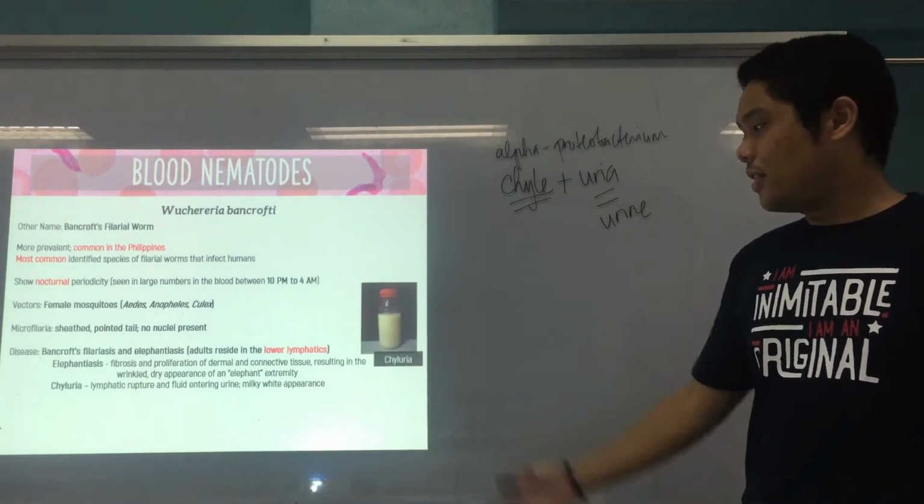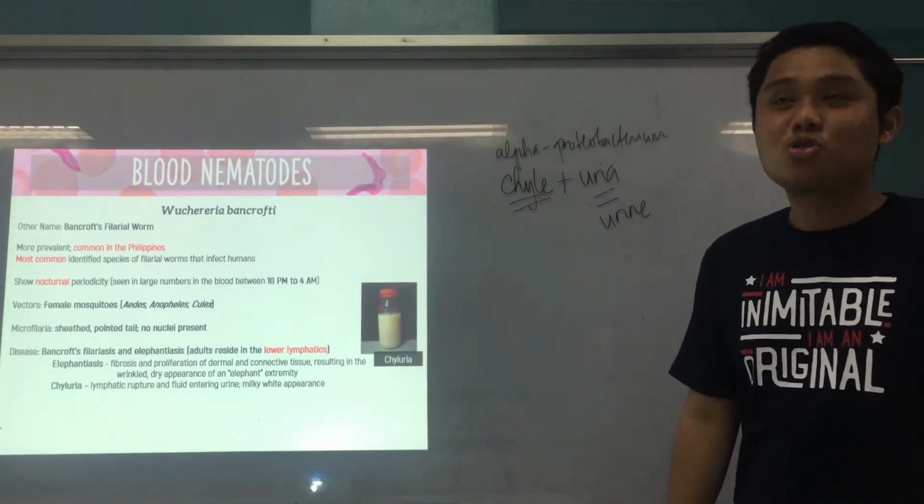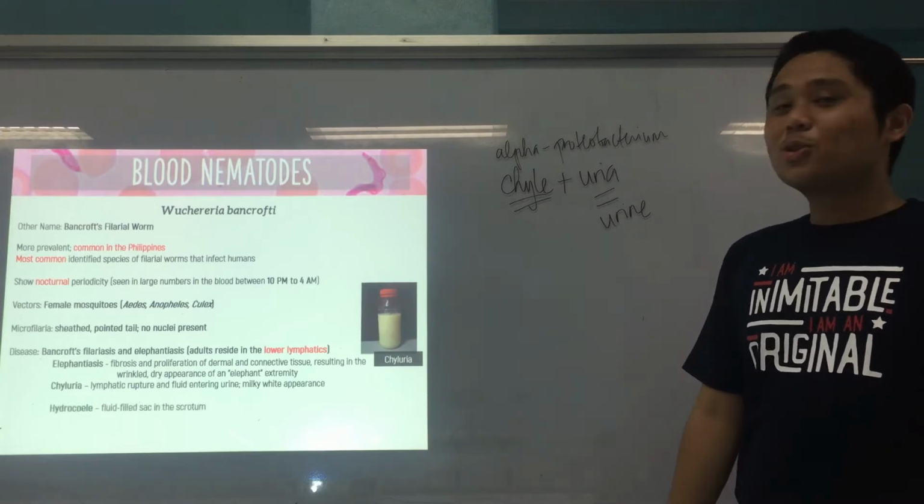And lastly, we have, this is chyluria, right? So you can see it looks like a brush, bukong shake pala, charot.